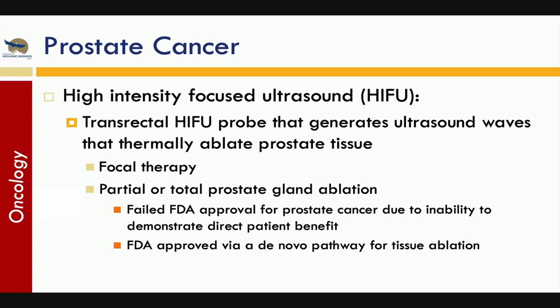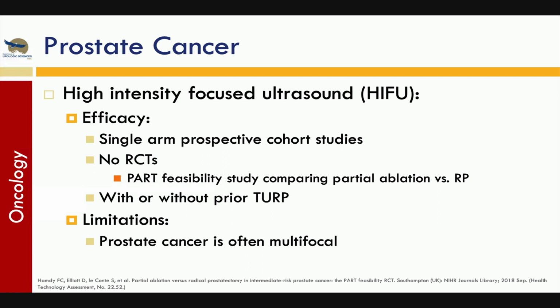But obviously, people have been using it and trying it for that application. And the literature isn't very strong, not enough to get FDA approval, because it's really only single arm prospective cohort studies. There are no RCTs at all, except for a feasibility study that looked at whether it would be feasible to perform an RCT, which has not been done yet.